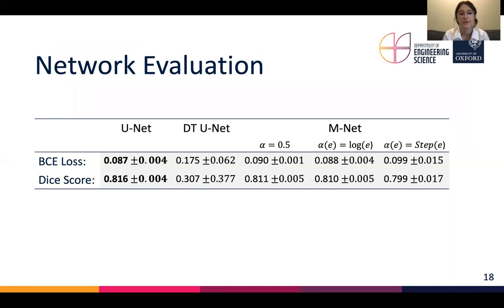The average performance across these 5 methods was then looked at using dice and binary cross entropy, and we found that UNet had superior results, which isn't too surprising as their labels best matched our ground truths. The DT UNet has a really high standard deviation, which again isn't too surprising, seeing as it wasn't learning across 3 out of 5 folds.